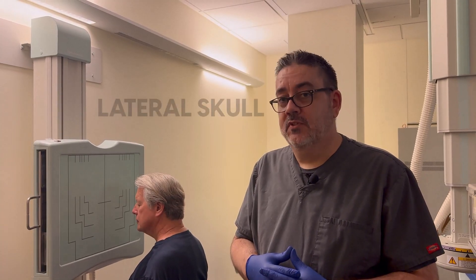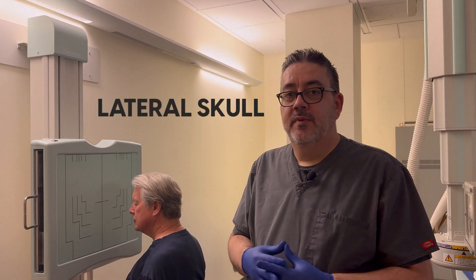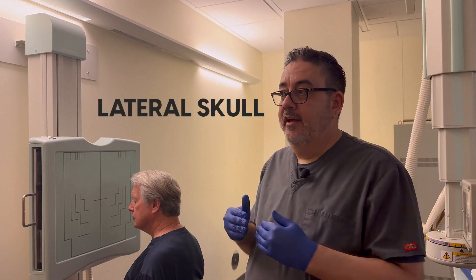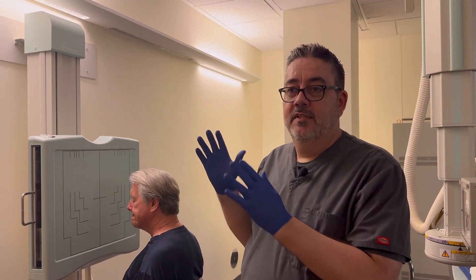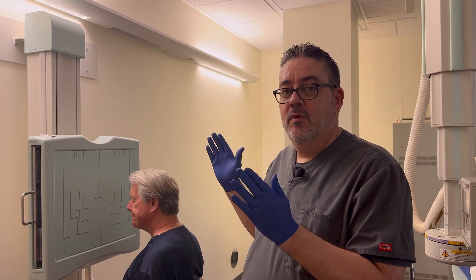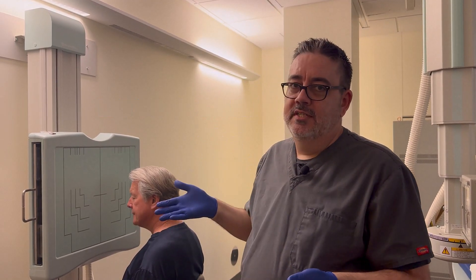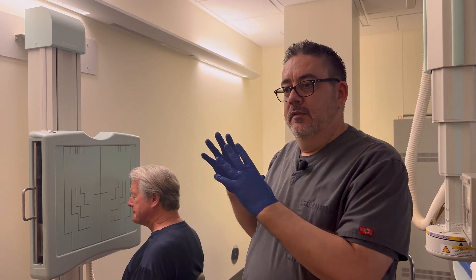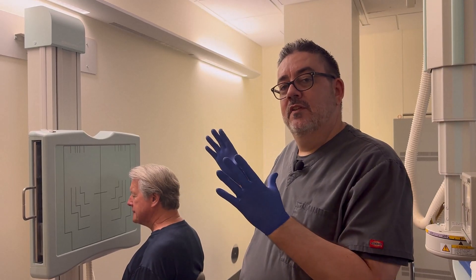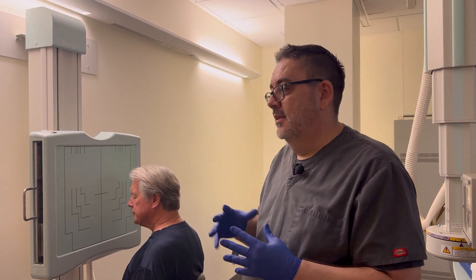Next we're going to look at the lateral skull. This position is a little bit different. You're going to have a collimated field of view that's more of a crosswise field. Most of you are using DR now, but the orientation of the light field should still be crosswise.